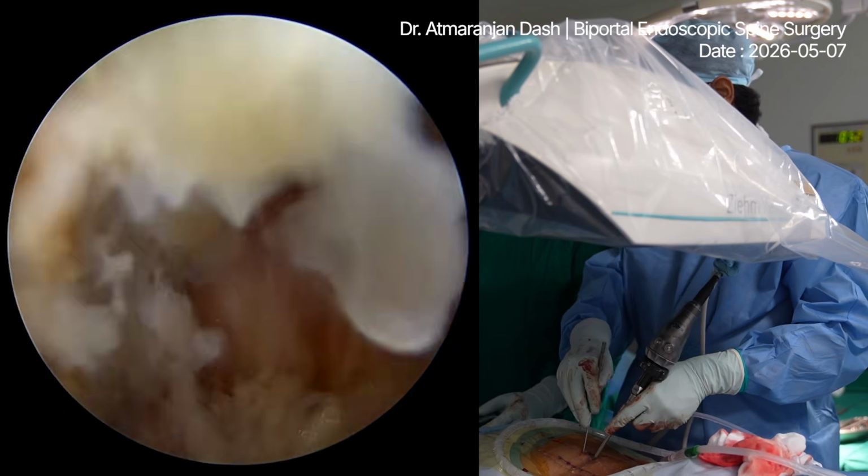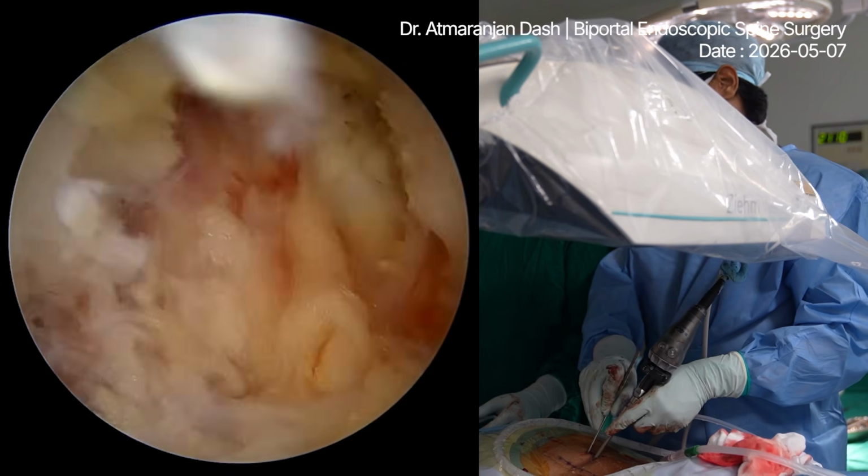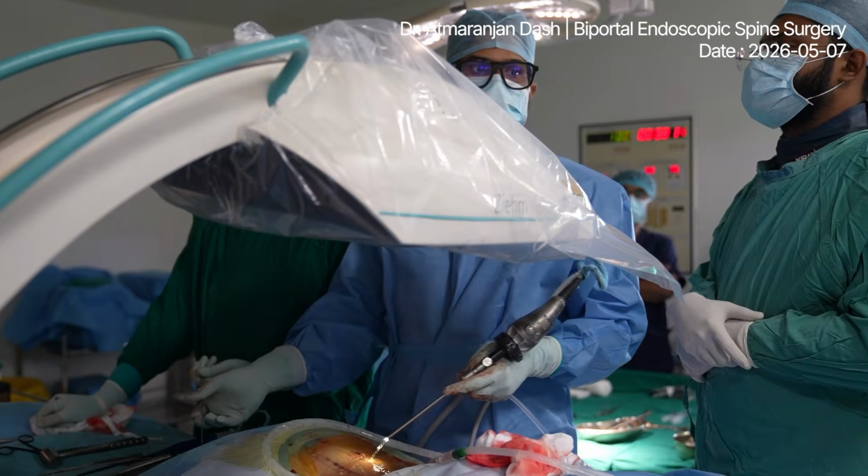Okay. So now the foraminotomy is over for this level. Thank you so much.